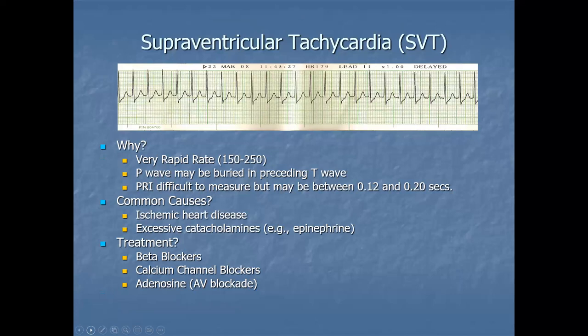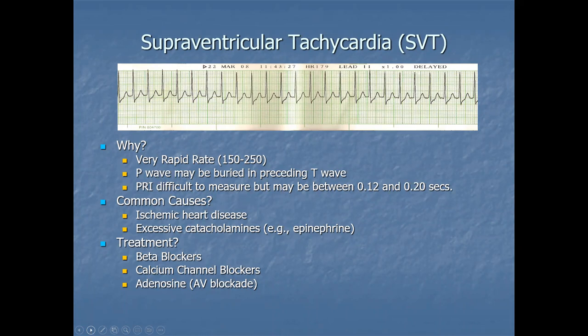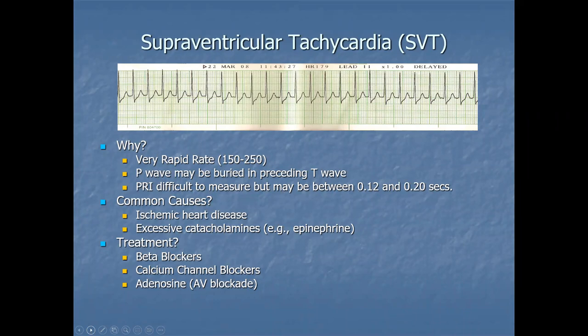Supraventricular tachycardia (SVT): very rapid heart rate of 150 to 250. The P wave may be buried in the preceding T wave because the rate is so fast. PR interval is difficult to measure but may be normal if measurable. Common causes include ischemic heart disease and excessive catecholamines with significant beta-1 activity, such as epinephrine. Treatment: beta blockers, calcium channel blockers, and adenosine. Knowing these basic rate control drugs is important for the ACCS exam.